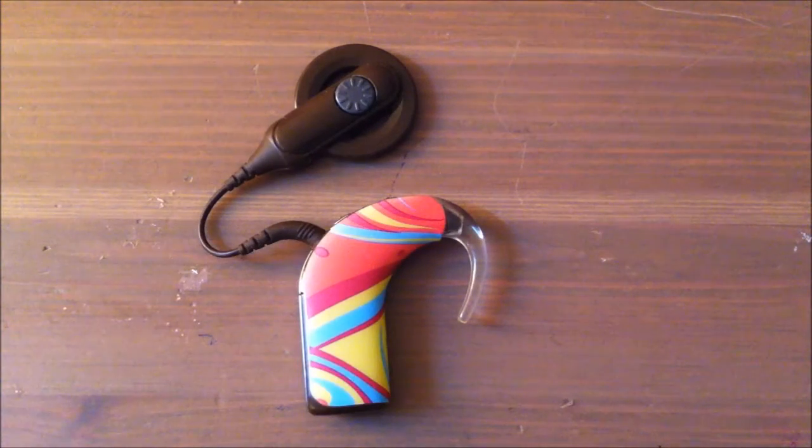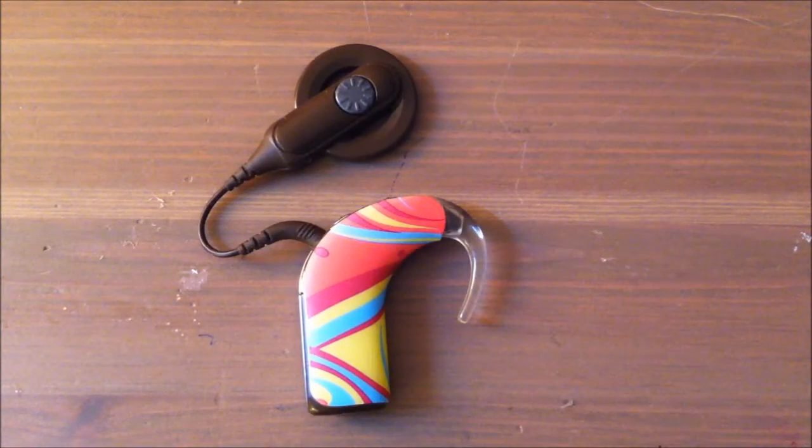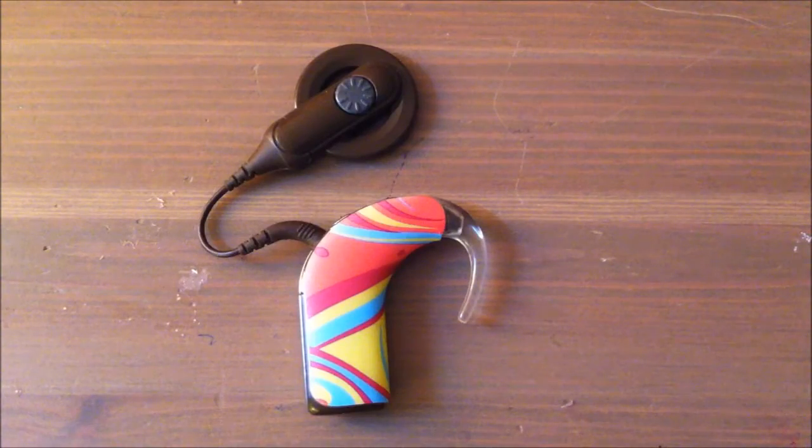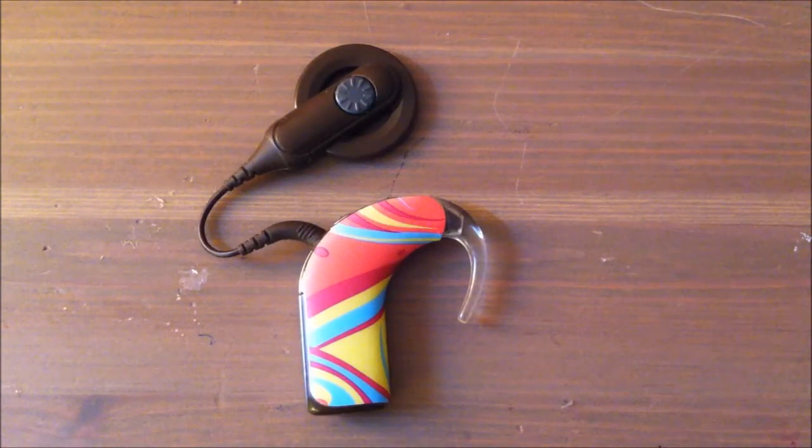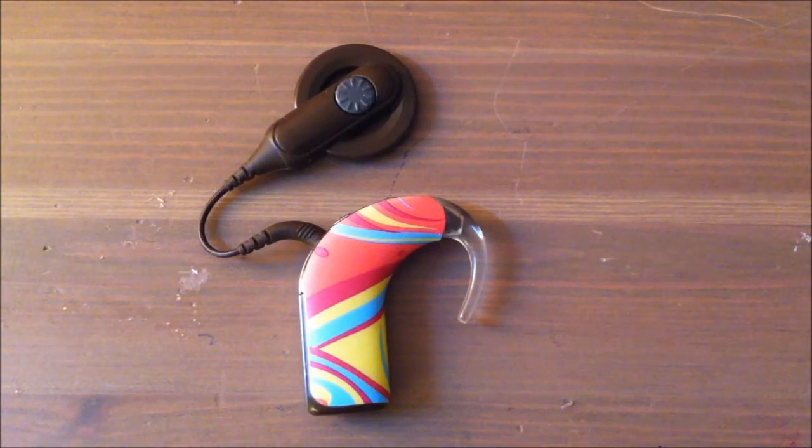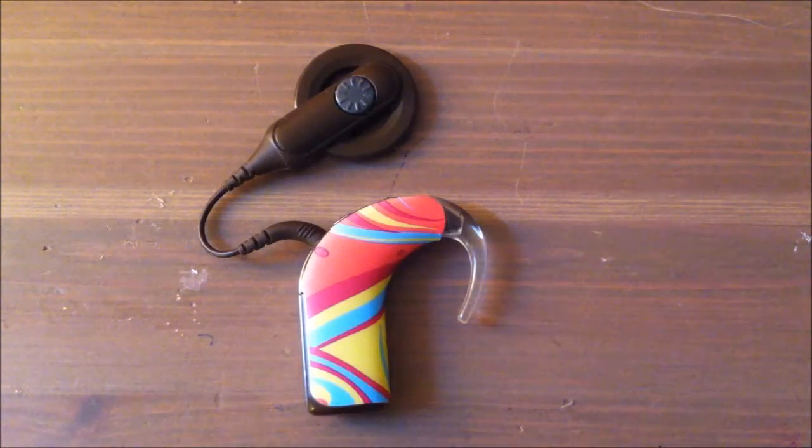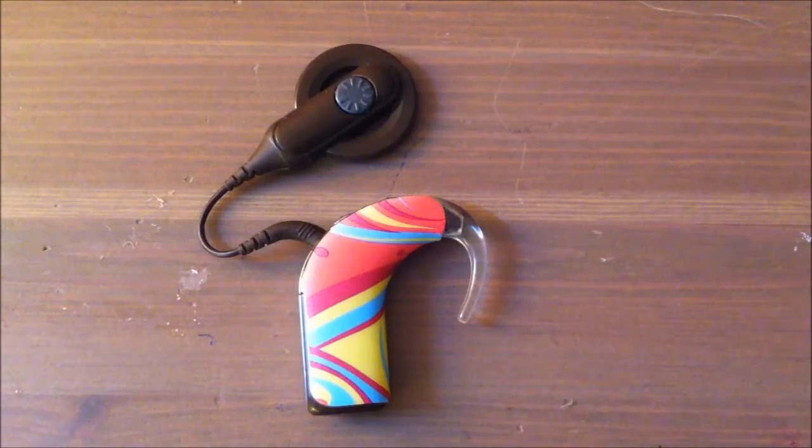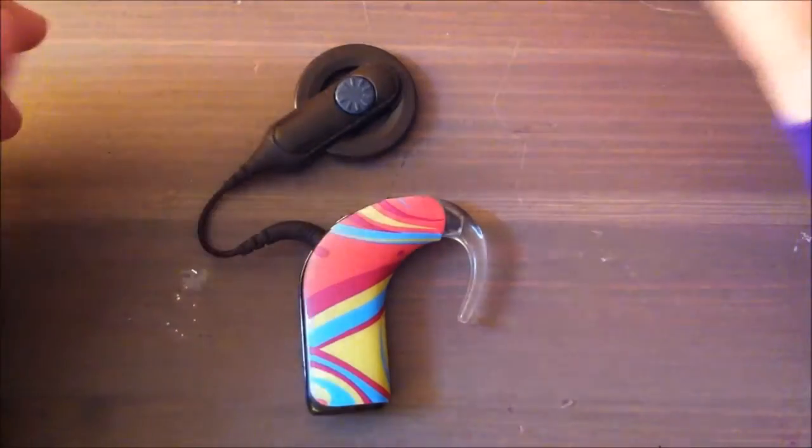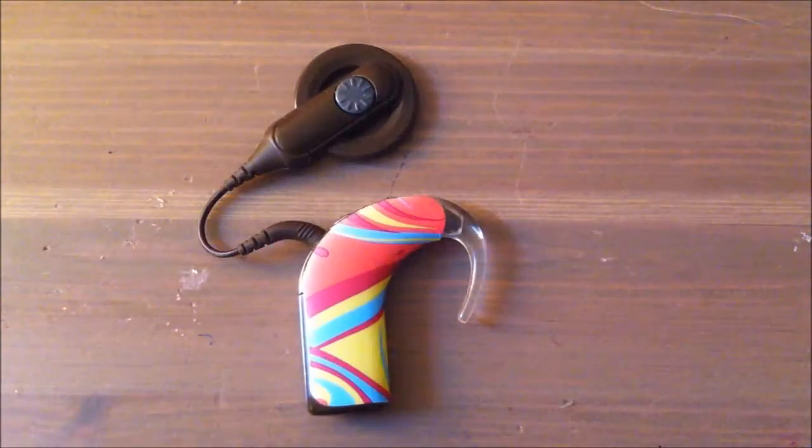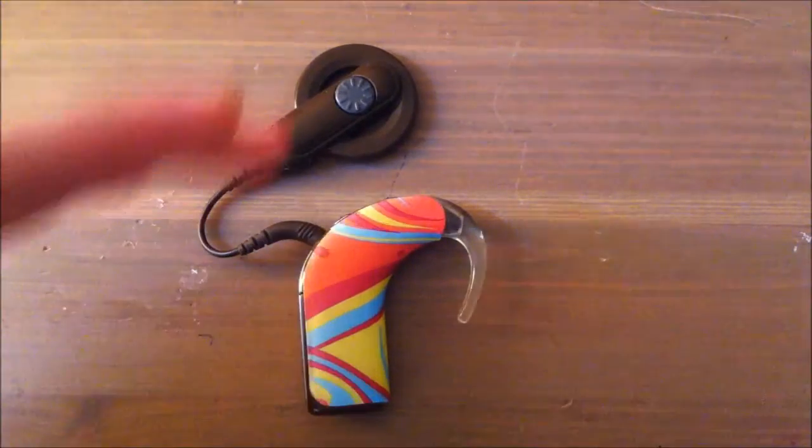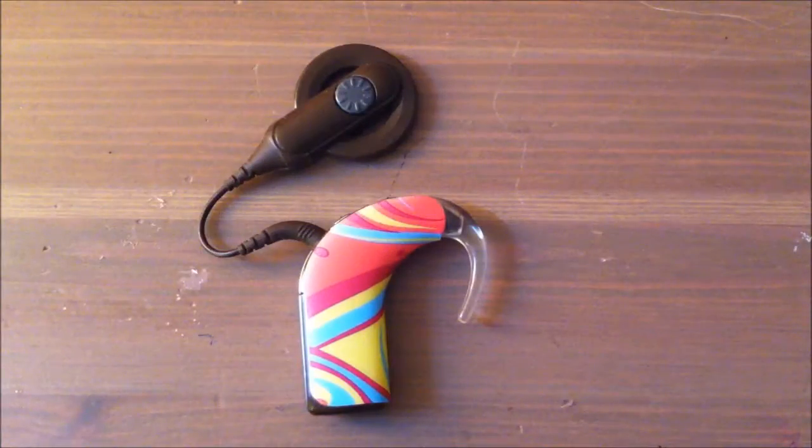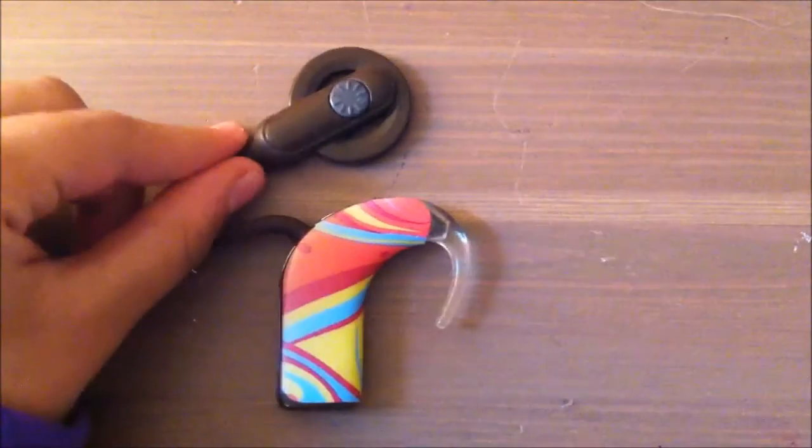Hey guys, what's up? Today I will be showing you the parts of a Nucleus 5 cochlear implant, which I actually wear. I'm going to be explaining the parts from the top going down.